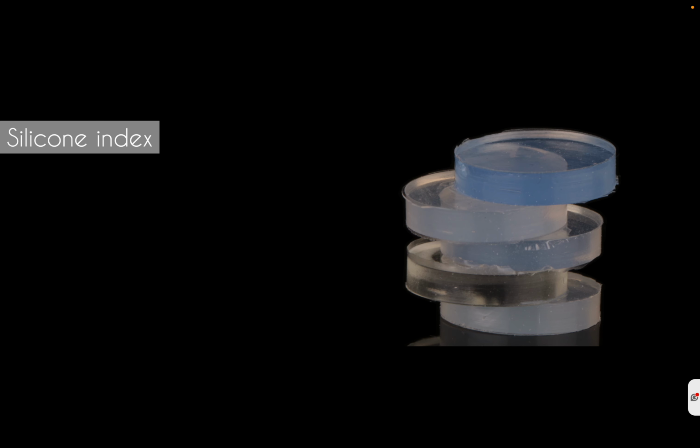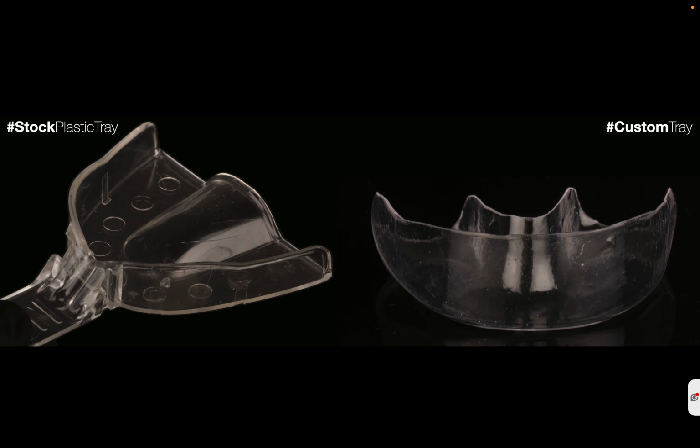Regarding the silicon index, we need to do this silicon index with some kind of tray. Why? Because this silicon, as you can appreciate, and if you have used it before, you know that it's not hard, it's not soft at all, but it has a gelatinous consistency.